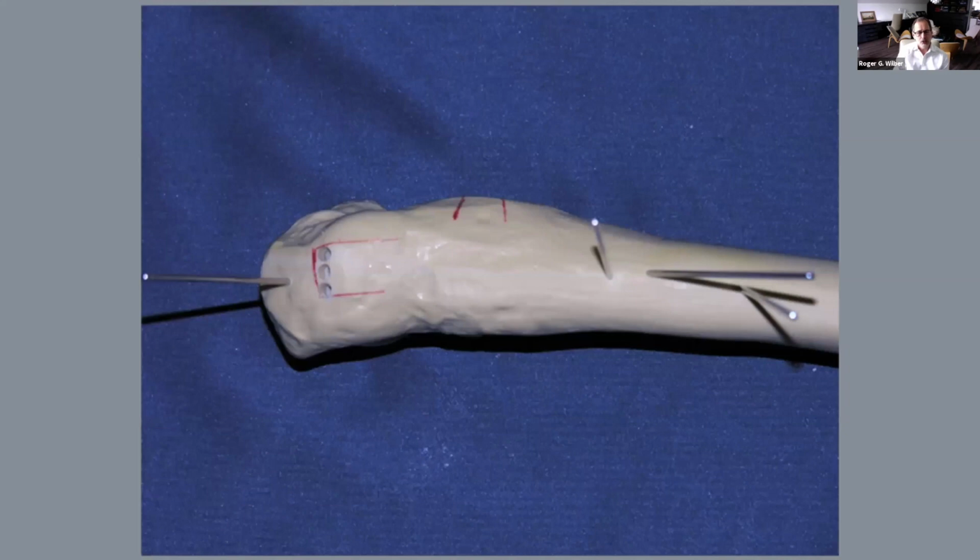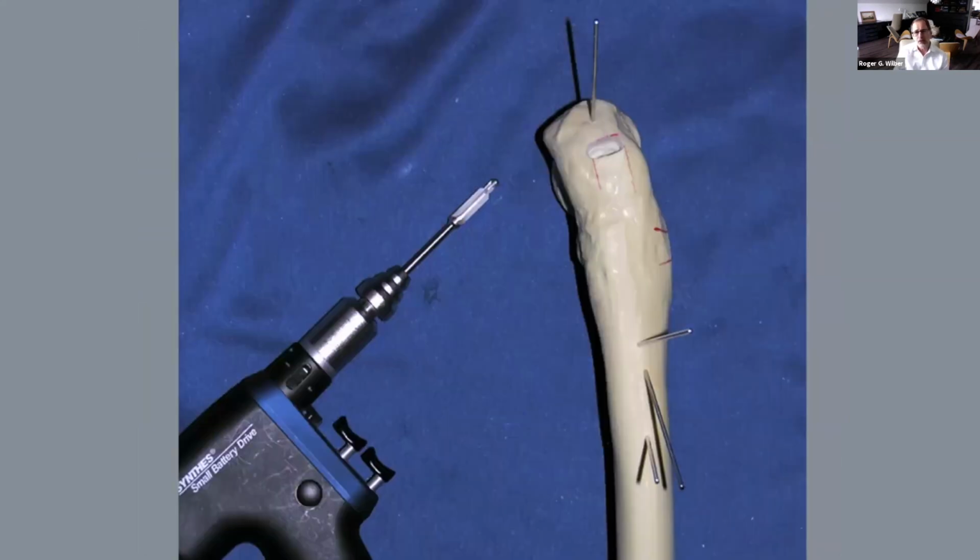And this is what you're looking at. In hard bone, I think it's very valuable to use the 4.5 drill bit and then subsequently route this out. A lot of times in a little bit softer bone, I'll just use an osteotome to open that little rectangle of bone, and I'll save that little bit of bone for subsequent bone grafting.